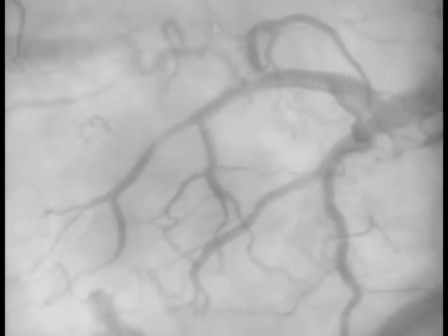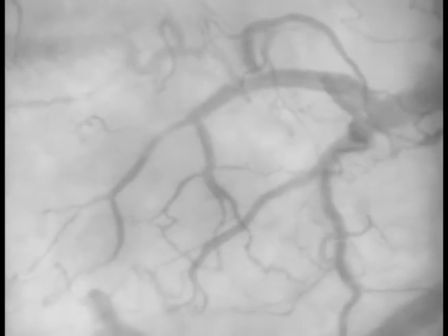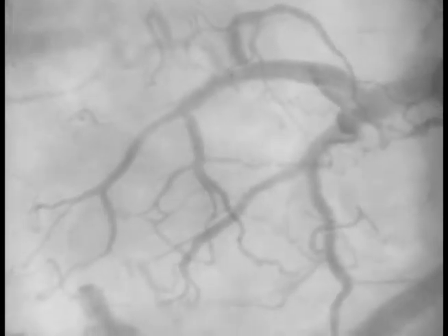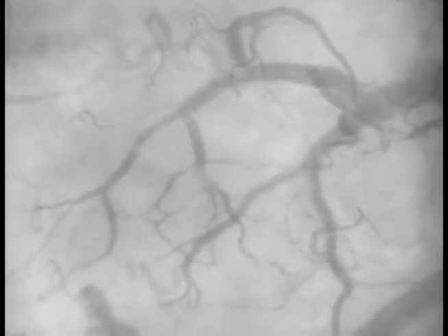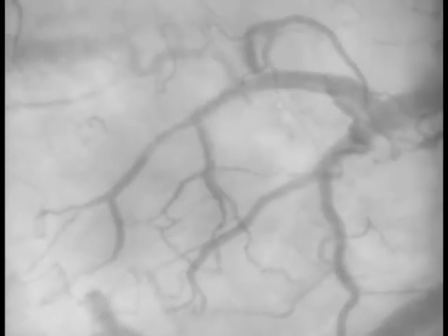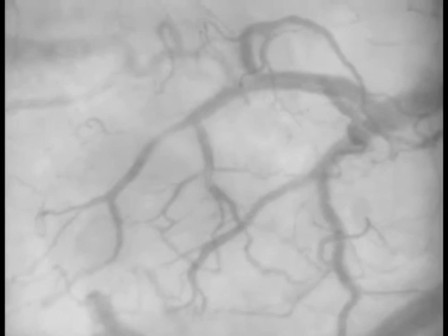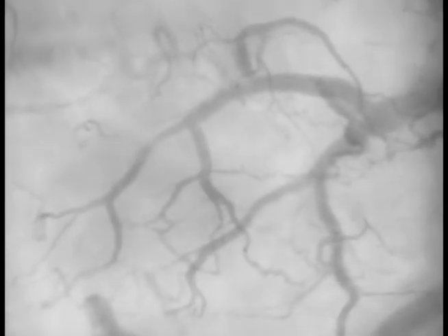We would score this a 1. Here's our second example. The intermittent sluggish flow in the medium-sized vessels in the middle of the video could possibly be due to pressure. Since we're not sure, we'll score this video a 1. Remember, a score of 1 means that there is suspected pressure. Scoring videos with a 1 does not stop us from analyzing it.